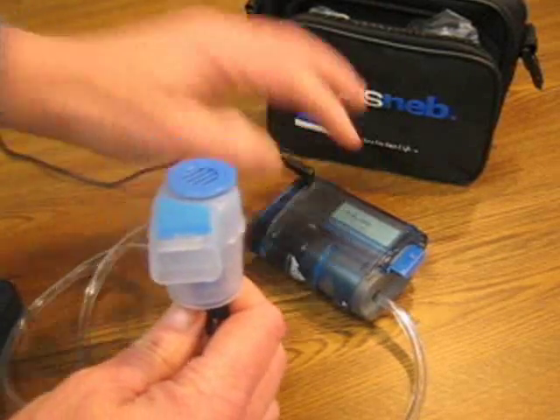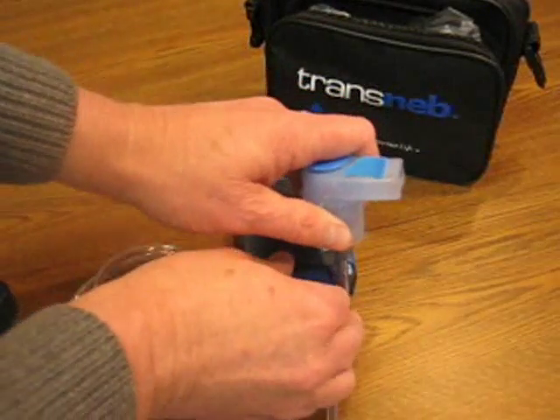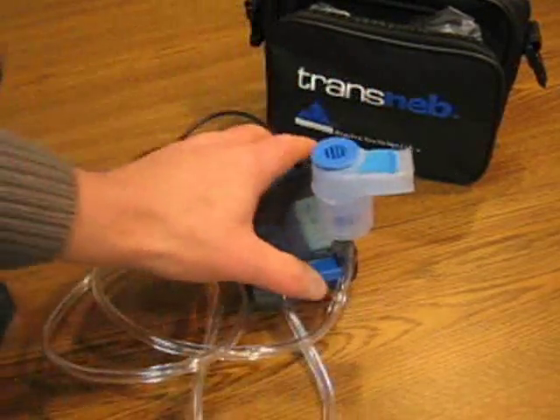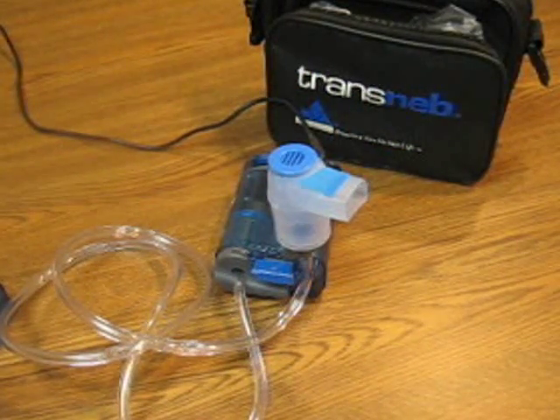You can also attach a child mask or an adult mask to the medication cup at this point. If you want to put it in storage, the compressor has a nice little storage adapter on the front of it that you can clip that into. Hope that is beneficial — thank you so much.